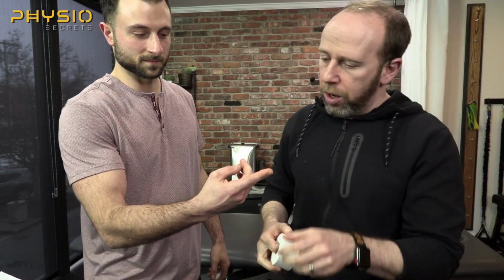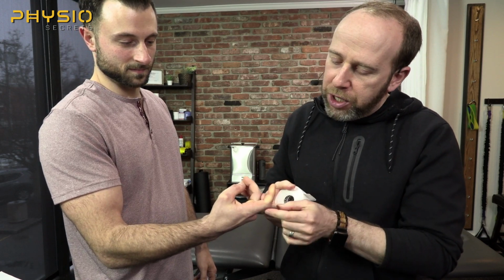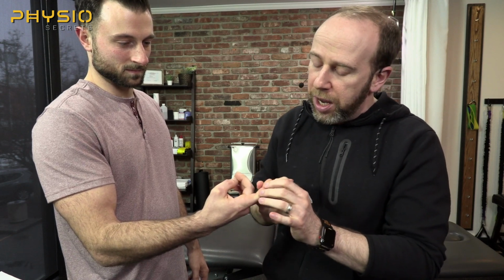So here's how it goes. I want to tape his interphalangeal joint. And in my hypothesis here, he had a hyperextension injury. So I want to block extension, but I only want to block extension for a couple of days because I don't want to give him a finger flexion contracture. So let's just say I wanted to block him like this. He comes off the basketball court, his finger's aching him, he had a hyperextension injury, and I just want to stop his interphalangeal joint from hyperextending.